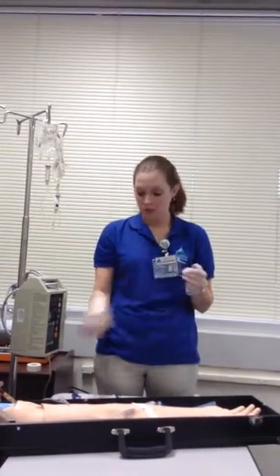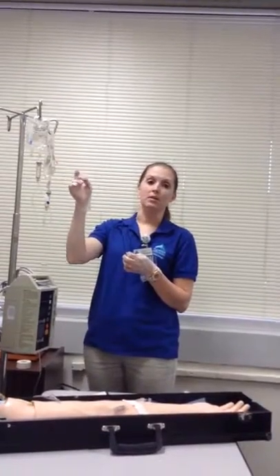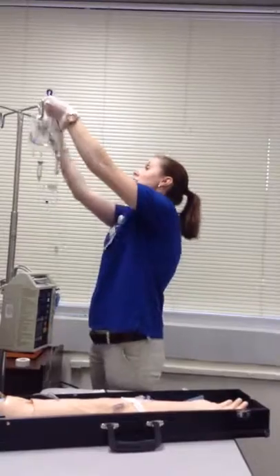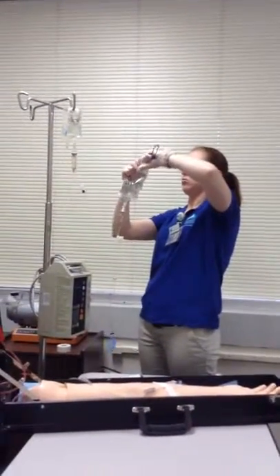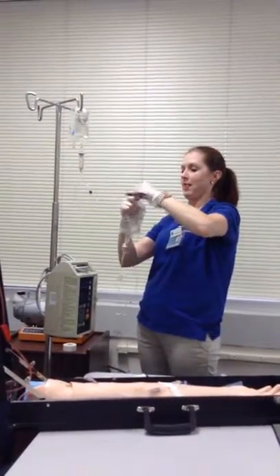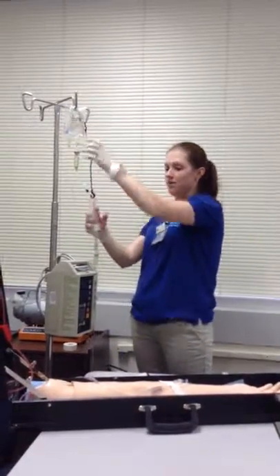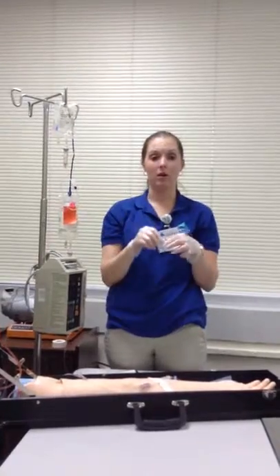I would then go ahead and lower my primary med down to establish a positive flow. Okay, that's lower. I would then go ahead and get my alcohol wipe.